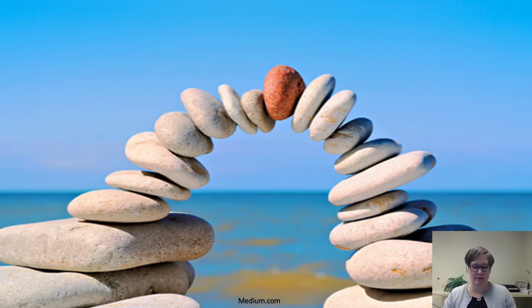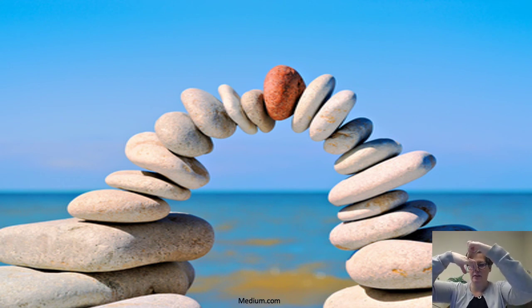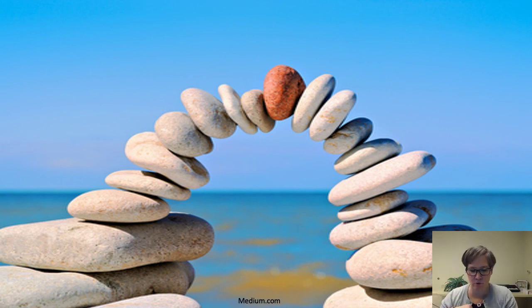So think of it like this. The keystone of the trachea is violated by placement of that tracheotomy tube right through the anterior apex of the trachea. And if the trach tube is large enough, not only are you sometimes removing that cartilage, but the pressure of that tube up along the cartilage wall is going to exceed that of the capillary perfusion pressure. So this really can't be avoided. The loss of that keystone really allows those two walls that were being held apart, with a membranous component posteriorly, that no longer exists. So then they collapse in and you have your A-frame deformity.